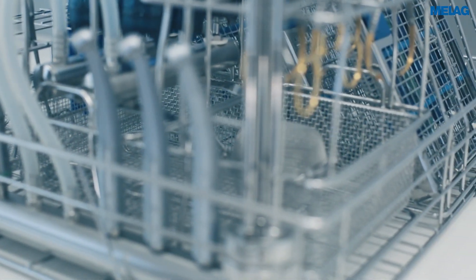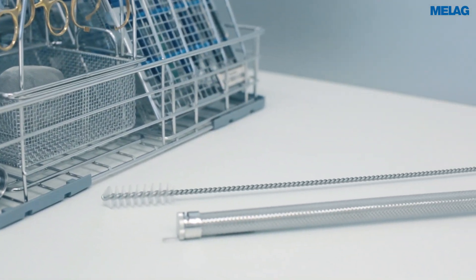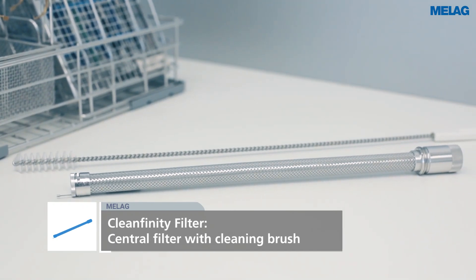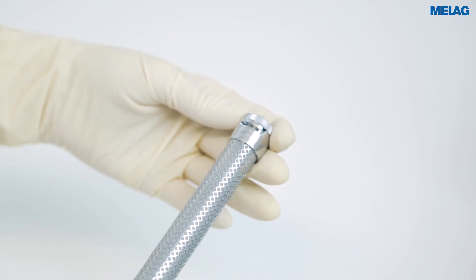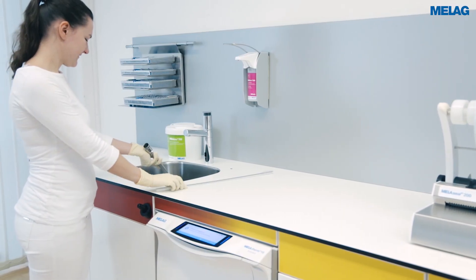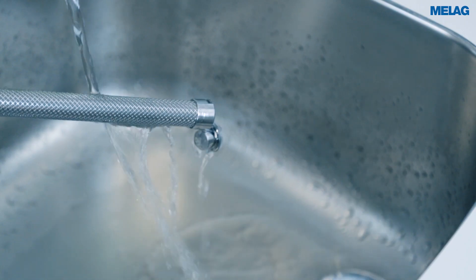The Cleanfinity filter permits even more economical and sustainable instrument decontamination. If this central filter is exhausted, please clean the filter. To do so, open the sealing cap at the end of the filter and clean the Cleanfinity filter thoroughly under running water using the brush included in the scope of delivery.